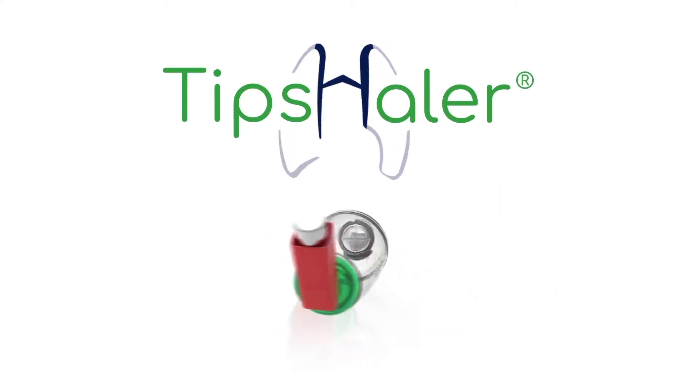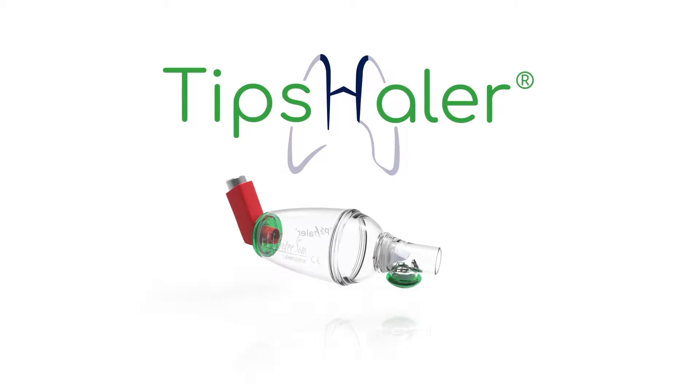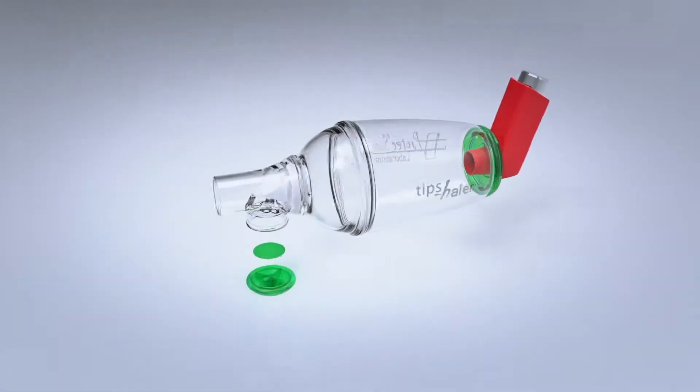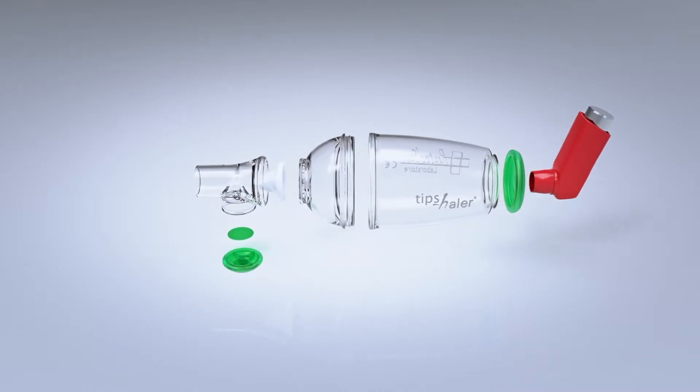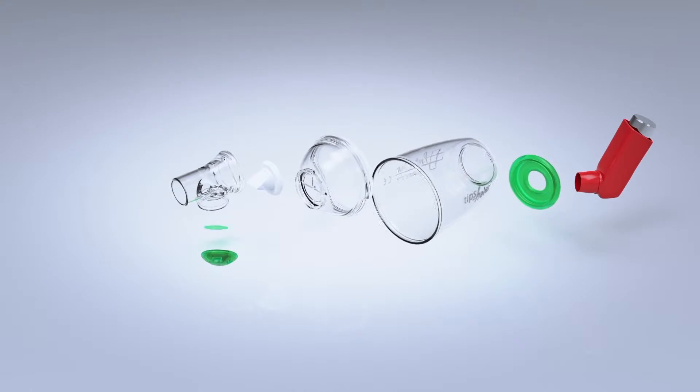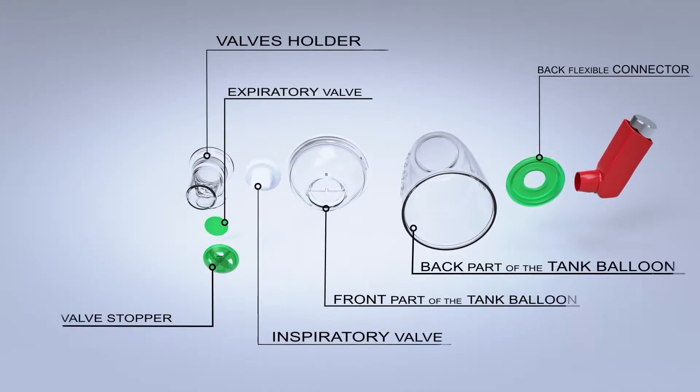Tipshaler is a French valved holding chamber manufactured in France in an ISO 13485 and ISO 9001 certified laboratory. Tipshaler was designed especially to optimise lung deposition of corticosteroids and minimise potential side effects.